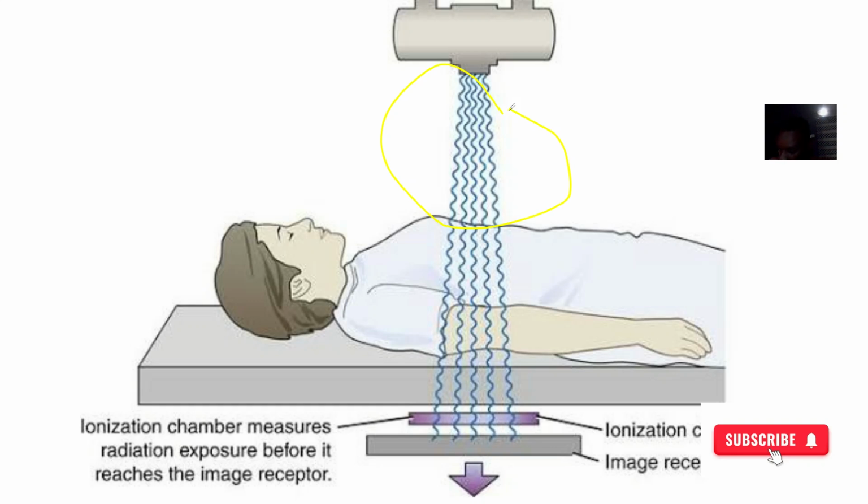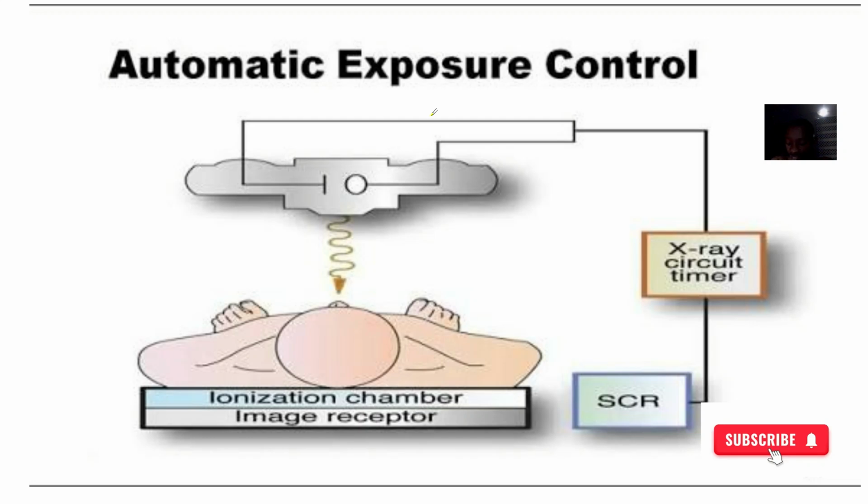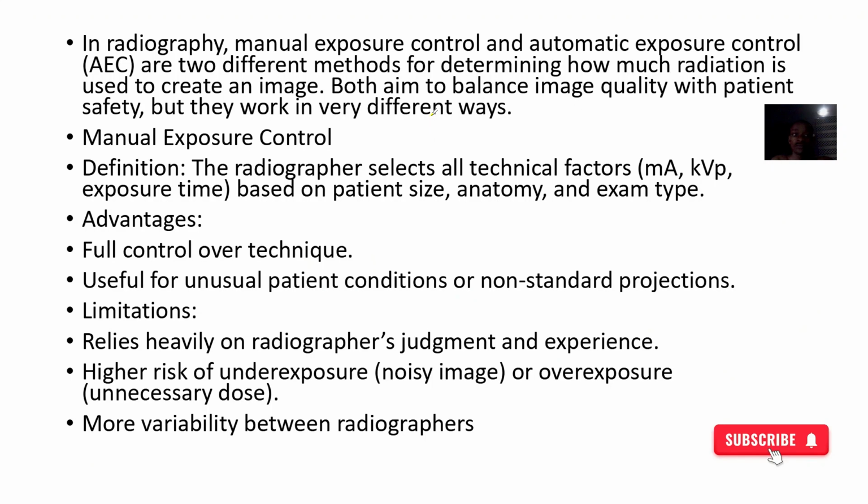So the control of this is basically done in two different ways, and you're looking at how much of this radiation energy is reaching the patient. Okay, so the manual control now.